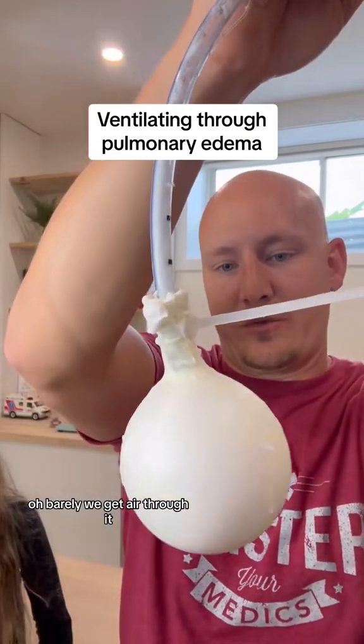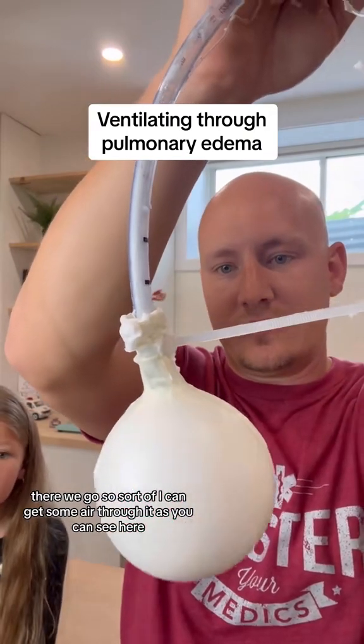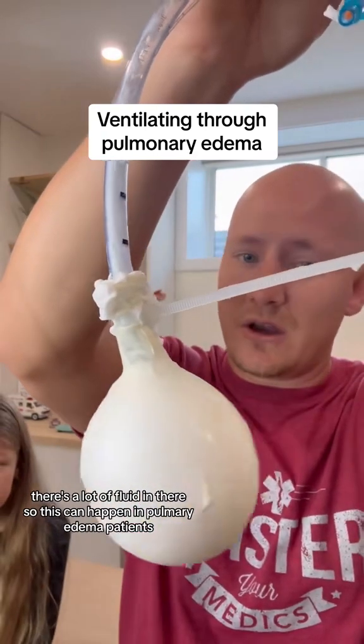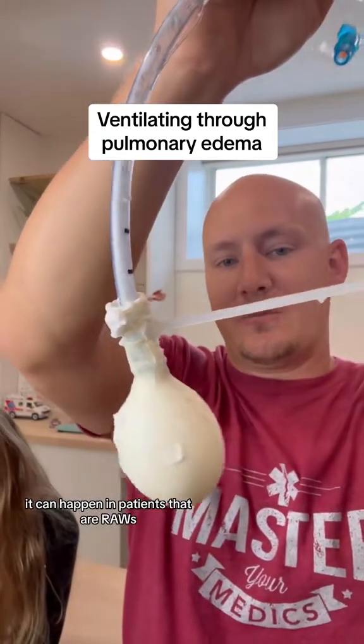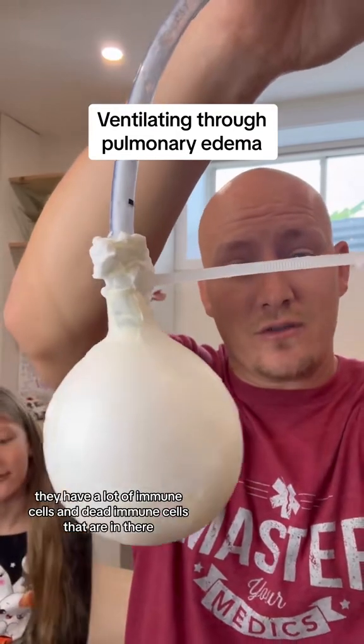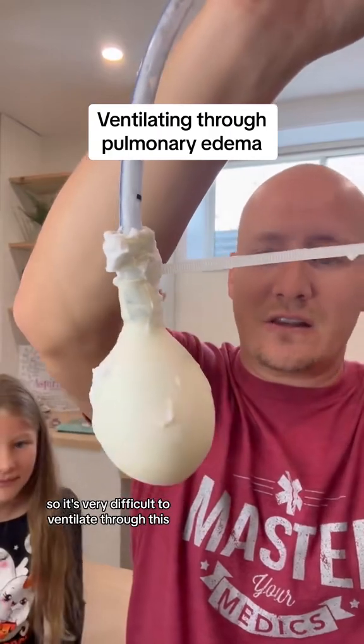I can barely even get air through it. I can get some air through as you can see, but it's quite difficult — there's a lot of fluid in there. This can happen in pulmonary edema patients, in post-ROSC patients, and in patients with ARDS who have a lot of immune cells and dead immune cells in there. It's very difficult to ventilate through this.